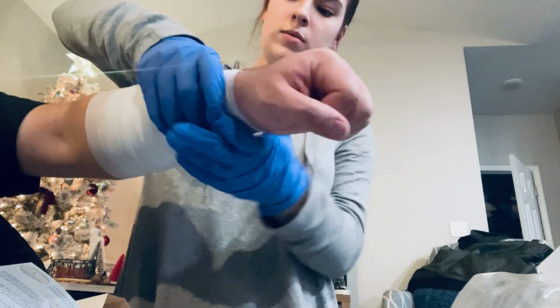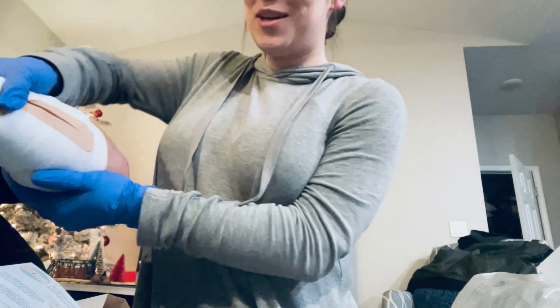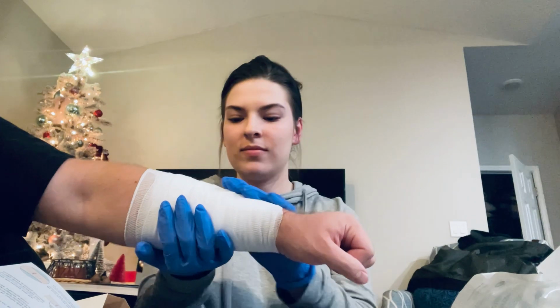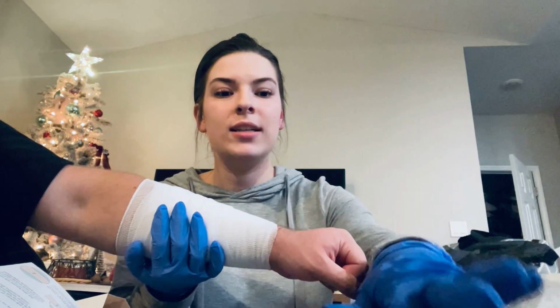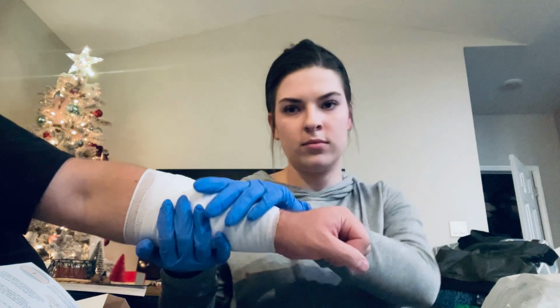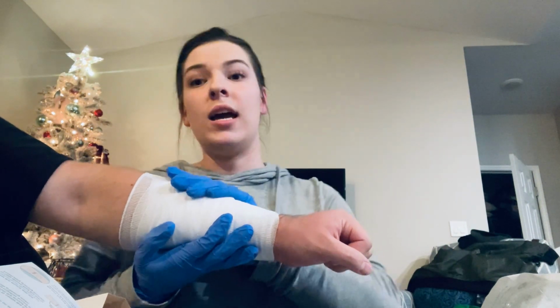I don't know if you can see the tape, but so then do that to secure the dressing and then the bandage.